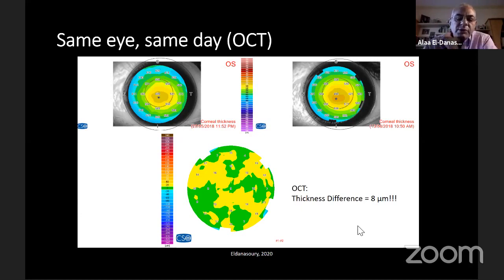If you do the measurement with the OCT, you get totally different results because of the scatter. The Scheimpflug is an optical way to measure the thickness, and it is much affected by the scatter that increases a lot after cross-linking. So this was a red flag to me. I learned this many years back, and since then, I do not rely on my Scheimpflug measurement for any thickness.